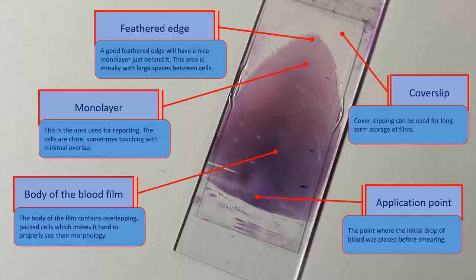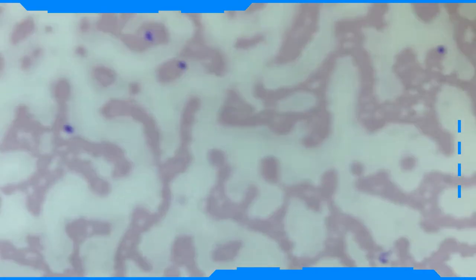The edges and feathered tail are useful as large cells, organisms such as microfilaria, or large clumps can be pushed out there. Hence, when making a smear it is important to ensure, if possible, that the spreader is narrower than the width of the slide and cover slip.